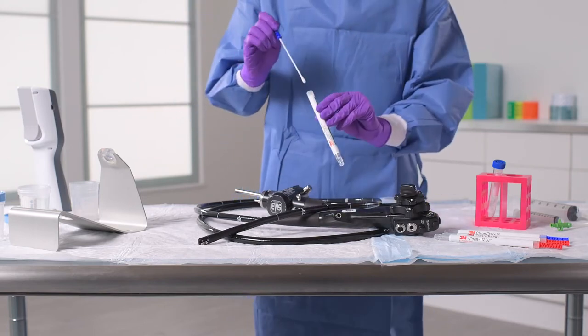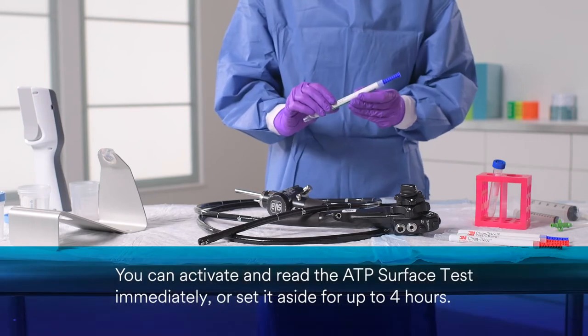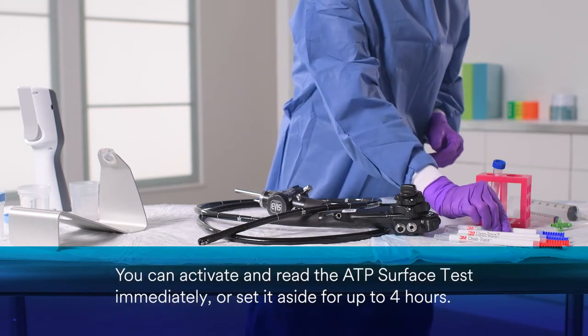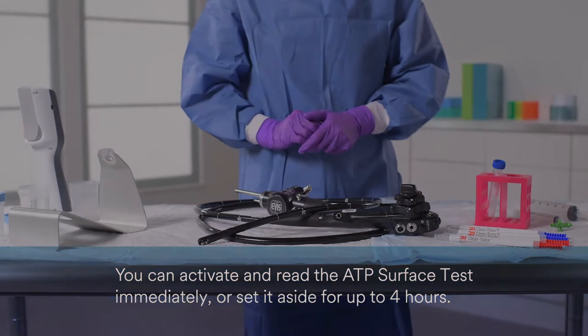Once you've collected the sample, insert the test back into the device sleeve. You can activate and read immediately, or you can wait until the next steps are complete. You have up to four hours to activate and read this test.